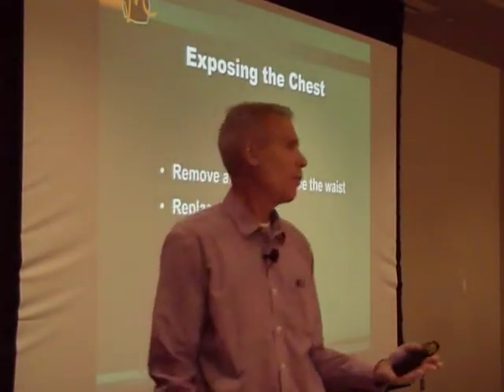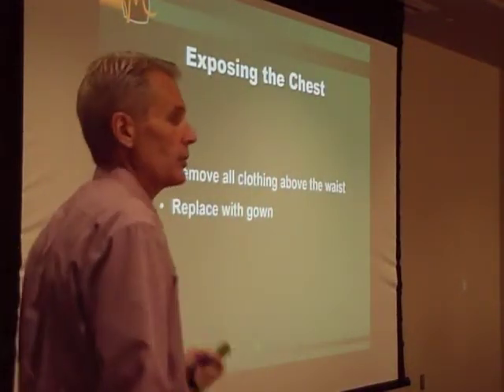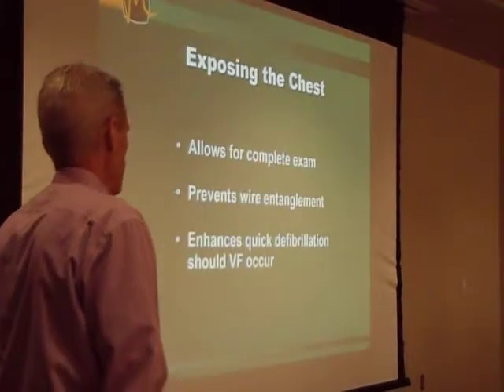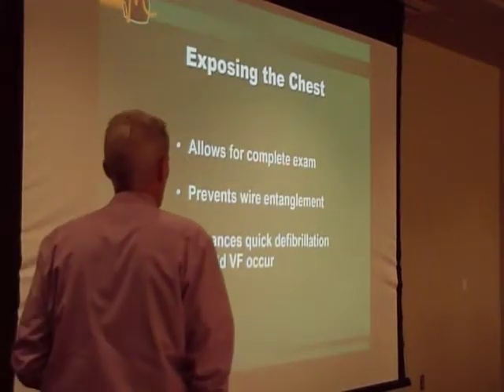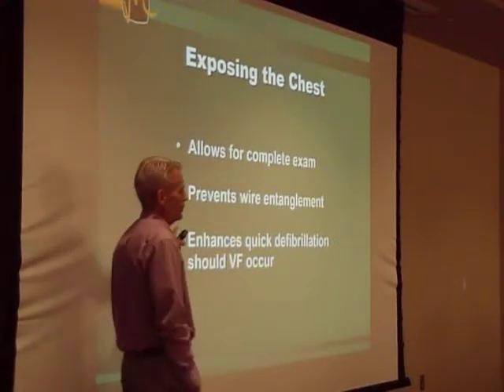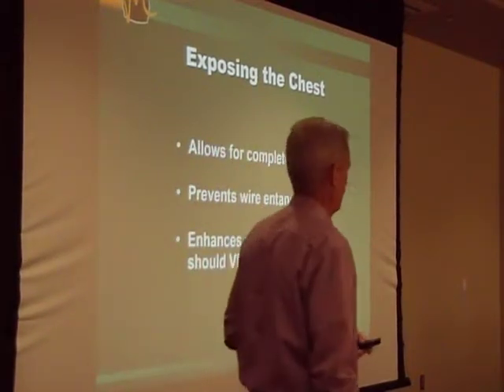You guys could do that if you wanted to. You have access to sometimes the linen at the hospital, so you can carry a couple in your truck, and it makes it much easier. It allows for a better complete exam and doesn't allow for wire entanglement. Let's face it, if your patient should happen to arrest on you, you've now got quicker access to their chest.